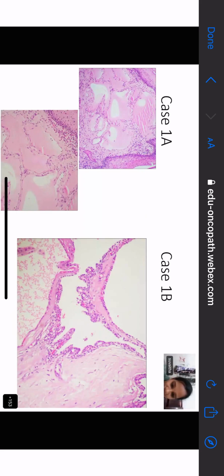I thought it was a continuous lining, and the cells have the nucleus appearing flattened. Yes. So you said two things. You said the nucleus appears flattened, and you said that it is a continuous lining. Does that make it an epithelium?